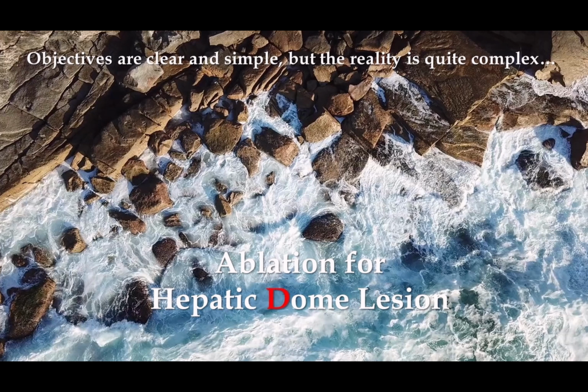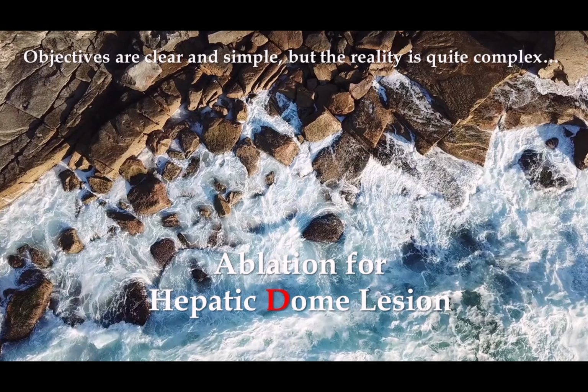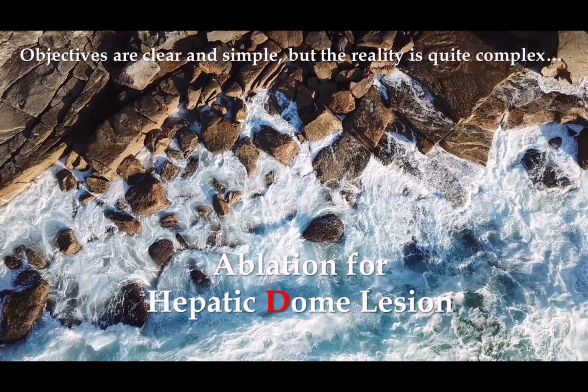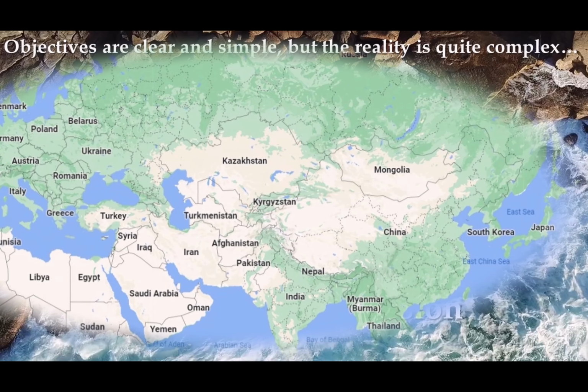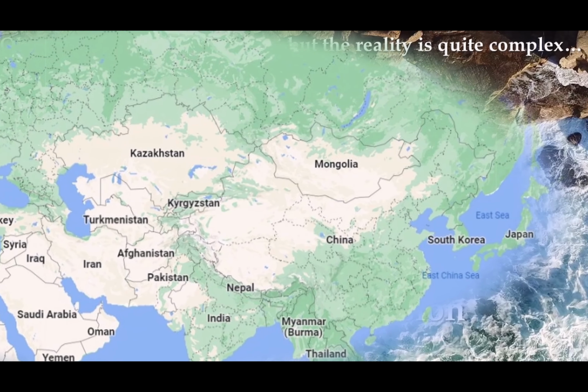So I think there are many kinds of complex factors to achieve the best result of hepatic dome lesion ablation. So this talk will be a good opportunity to understand how to ablate a hepatic dome lesion, mostly in Asian countries.